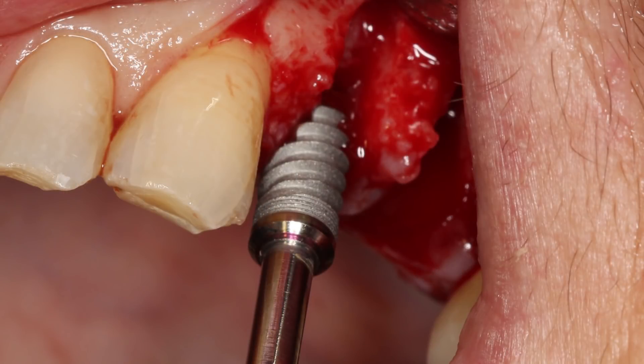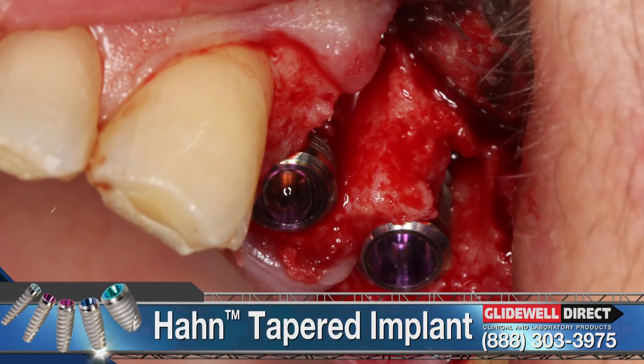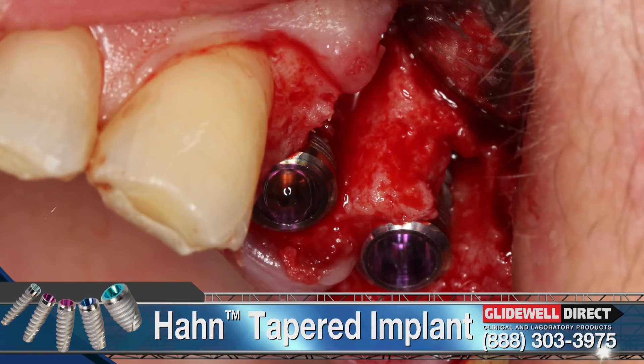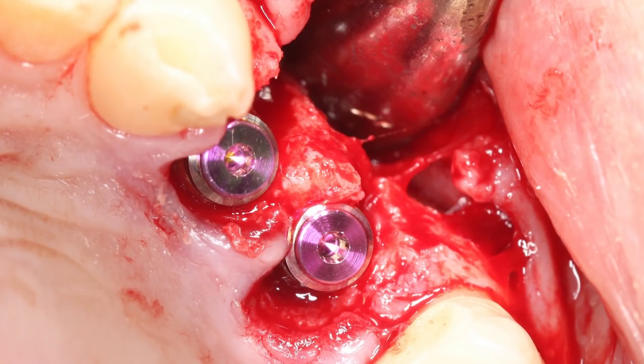A 13 millimeter long implant was placed into the area of the maxillary first bicuspid. Digital radiography confirmed the slightly subcrestal placement of the implant into the socket. A 4.3 millimeter by 11.5 millimeter Han tapered implant was placed in the maxillary second bicuspid site. After threading the implant into position, the facial bone defects were evident. The defects would be corrected using the allograft material and resorbable membrane. The tapered shape and aggressive thread design of the Han tapered implants helped achieve primary stability of 40 newton centimeters.